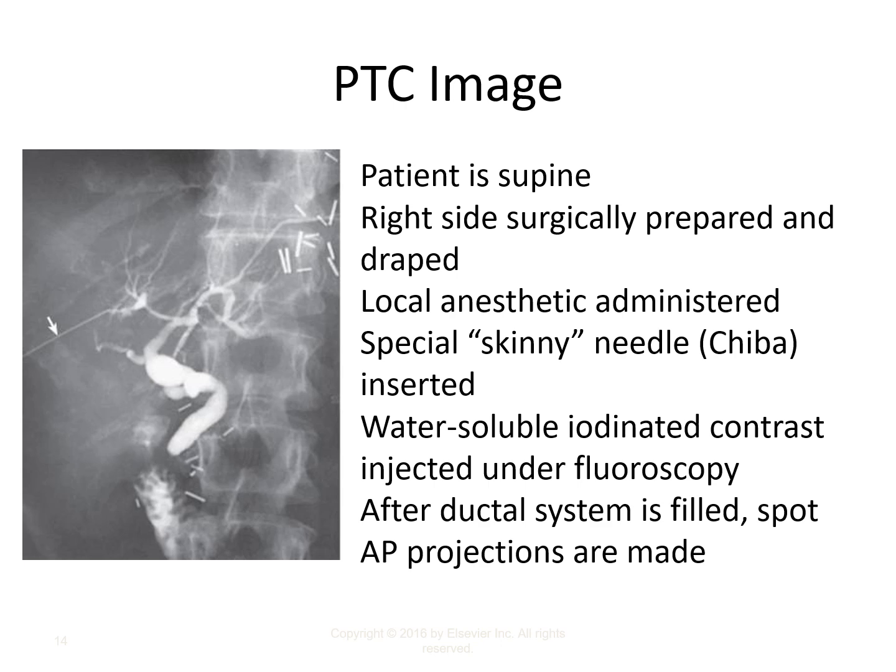Okay? A PTC uses what they call a chiba or a skinny needle, and it's exactly as it's described. It has a very, very tight lumen such that it's not going to promote excessive damage to the hepatic tissue. Hepatic tissue is very vascular, and if it's torn or cut by the needle, it could lead to internal hemorrhaging.